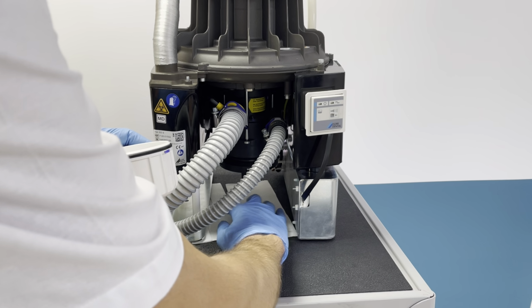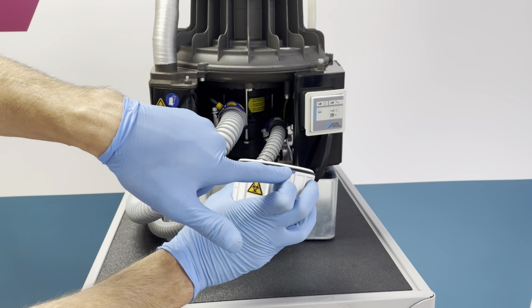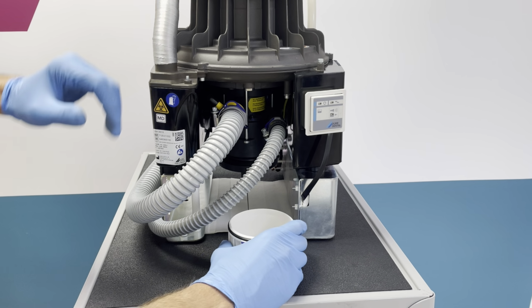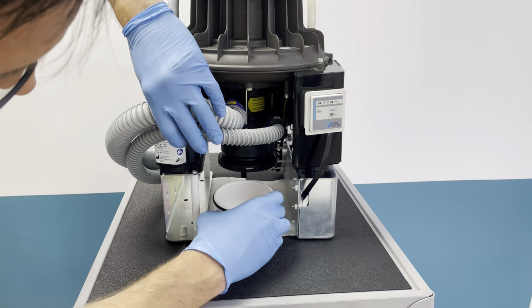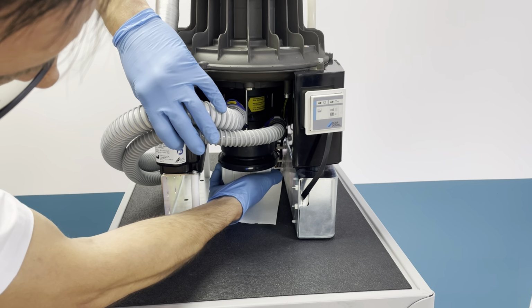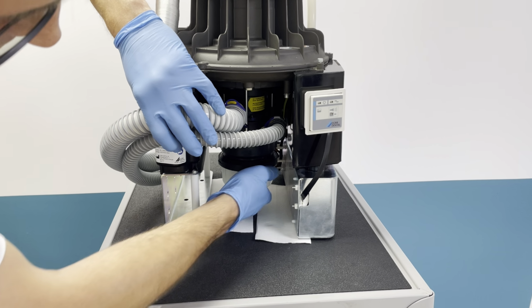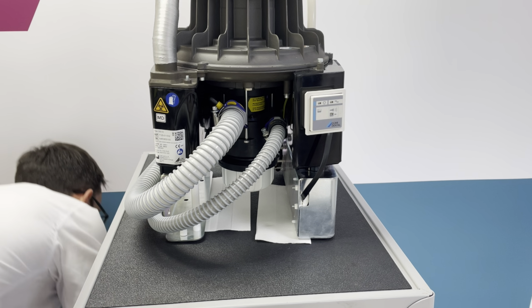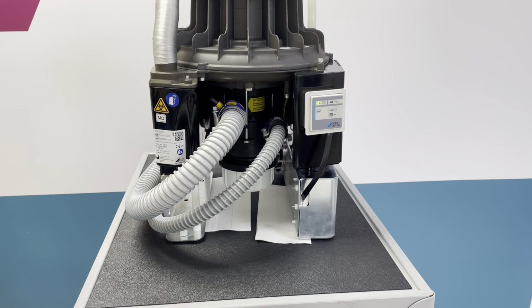And then bring your new pot to the machine. So what you're aiming for is, I've coloured these lugs in blue here. So there's keyways on the machine that will secure the pot. So if you slide the pot into position, lift, and then 1/4 of a turn clockwise, and that's the pot secured. You can now put power back onto the machine, and you're expecting to see a green light here.